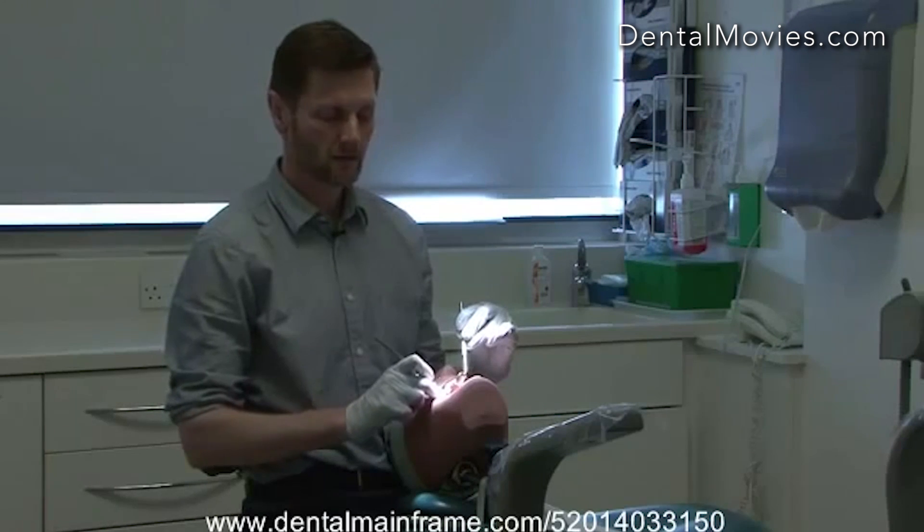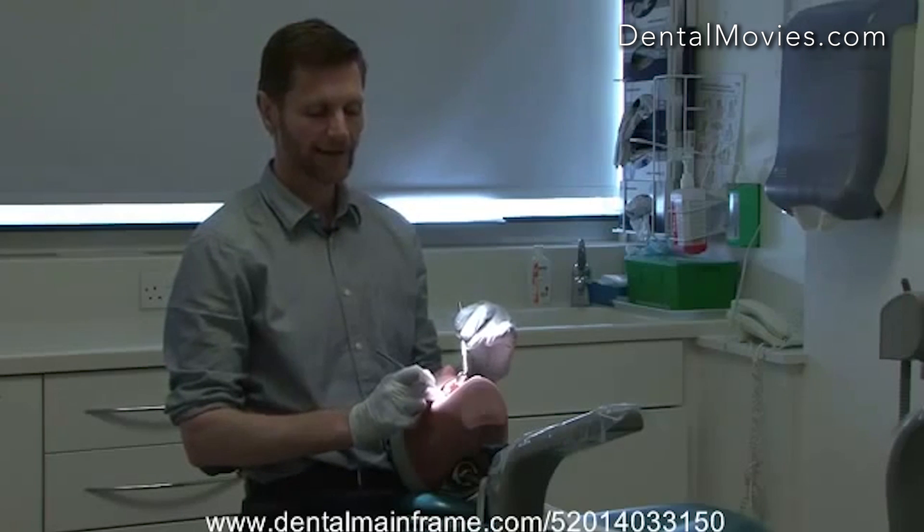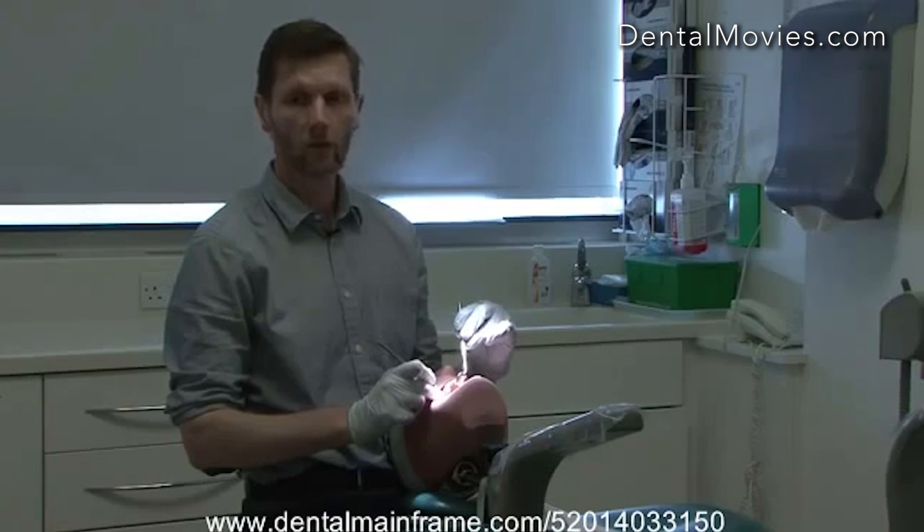This technique also gives the assistant — the dental nurse — much more access to the mouth to use suction. It's a very useful technique because it allows us to sit back and relax, work with the mirror, and still see what we're doing.